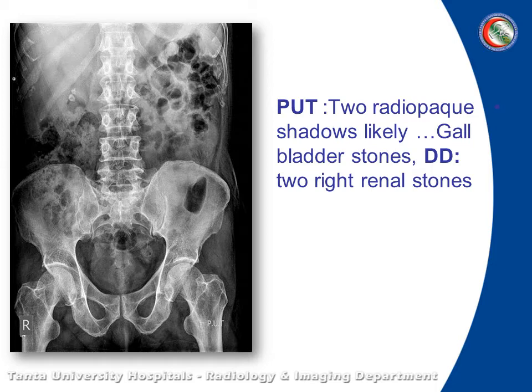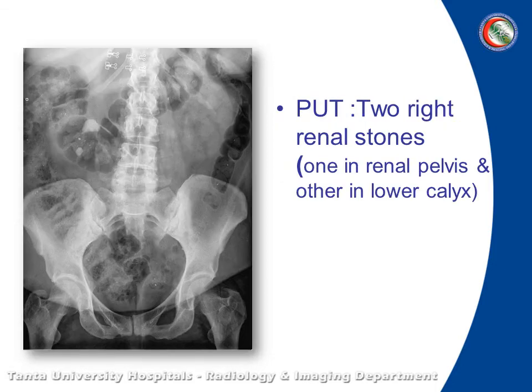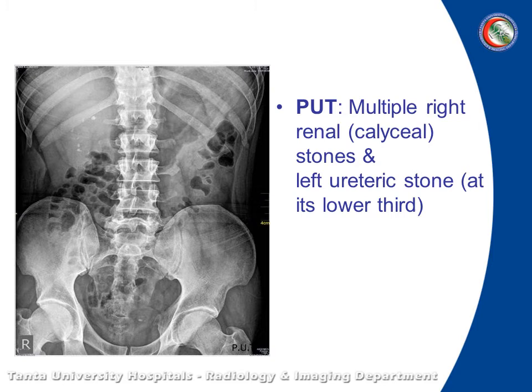This is a radio-opaque shadow in the right hypochondrium, likely to be gallbladder stone with differential diagnosis of right renal stone. Here is renal stone, very obvious. Multiple renal stones — multiple calyceal renal stones. There is also a left urinary tract stone. Here is a sign called the happy eye sign — when you easily identify one finding, like a right renal calculus, don't neglect the rest of the image. You should observe each part, as there may be hidden abnormalities — don't miss this small urinary tract stone.